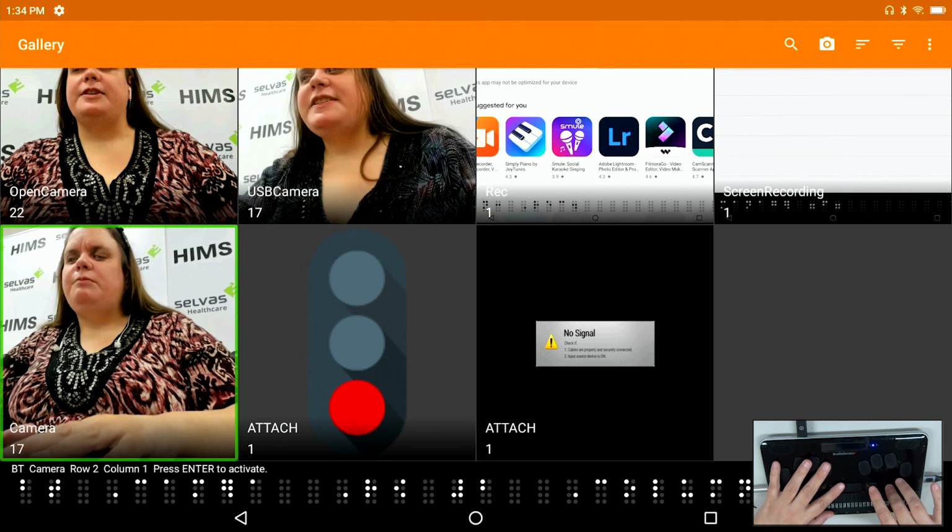So all the various apps that I've used, I can actually go to a folder for each one of them. Instead of having just all my videos in a list according to the most recent or however you decide to sort them, you don't have to sort them. These are all very organized.